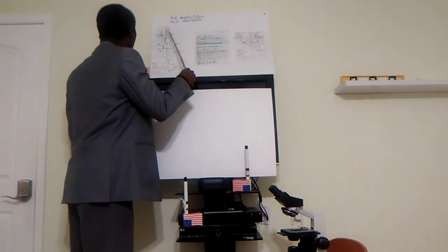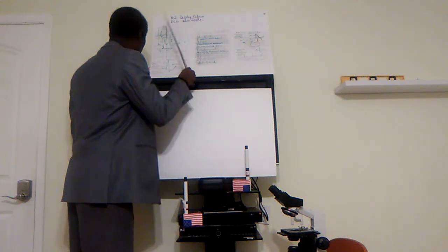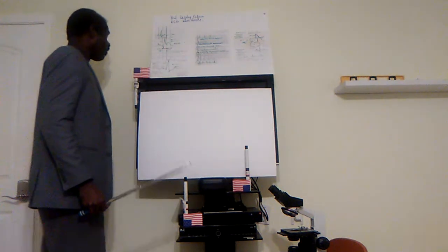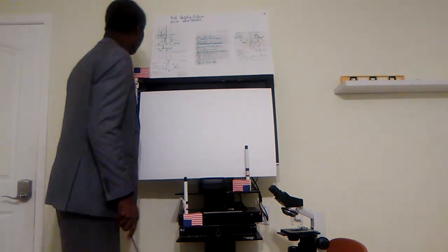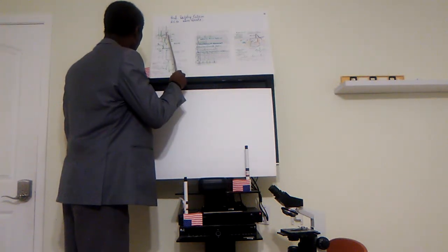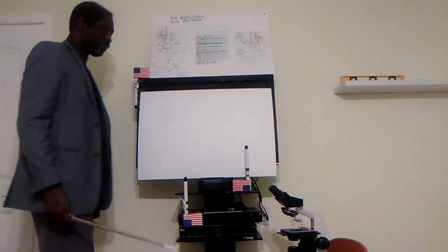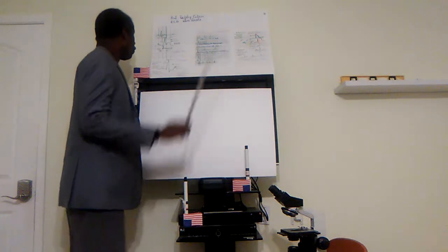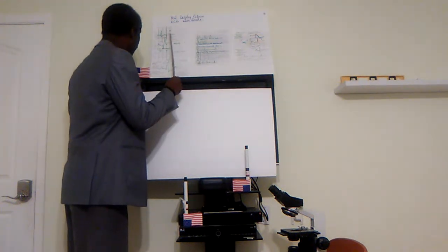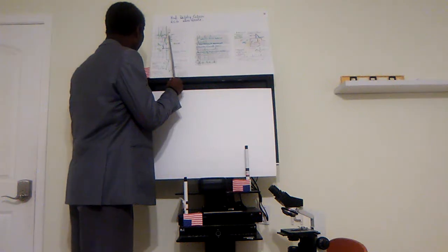Then we have the ST segment and the ST interval, and the T wave. The T wave represents the relaxation of the ventricles. There's a small U wave which is sometimes negligible, sometimes unseen, but there is a U wave, and the source of this U wave is not clear; it is said to be generated from the Purkinje fibers.